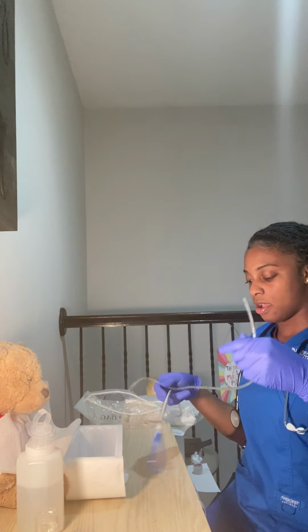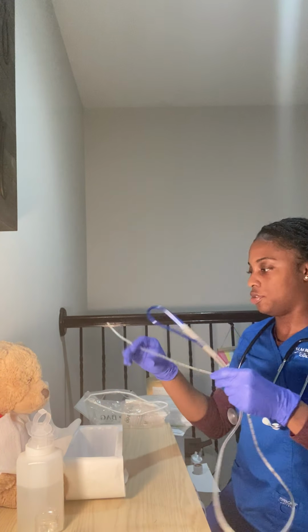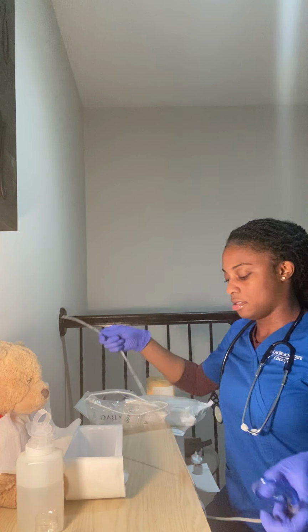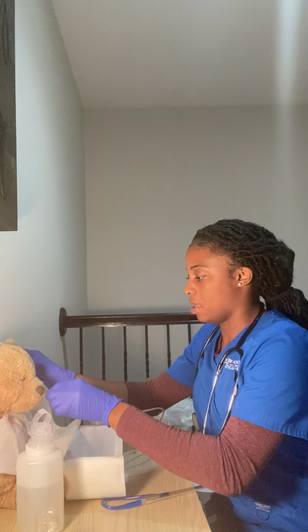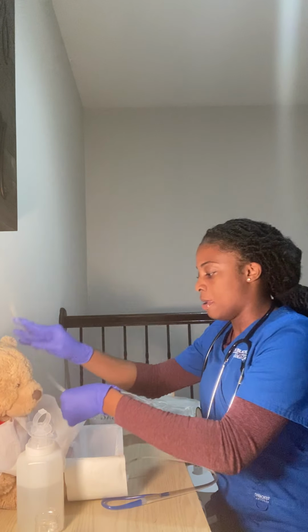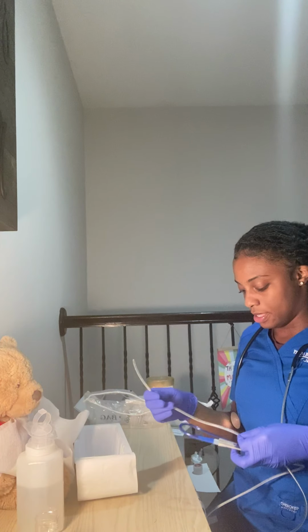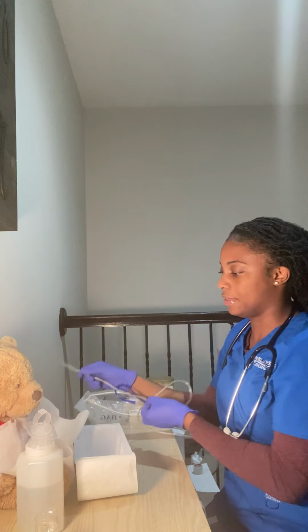Okay, so now, before I go ahead and lubricate my catheter, I'm going to measure it. I like to go from ear to nose to xiphoid. So I'm gonna go from ear to nose, down to the xiphoid, and we are at 30. My catheter has numbers on it, so I know where to stop. So I'm gonna stop at 30, okay?